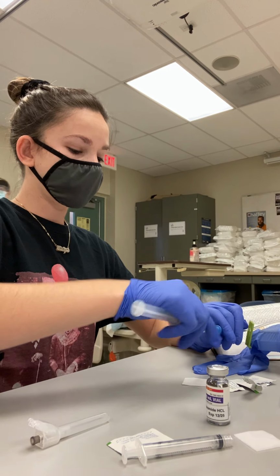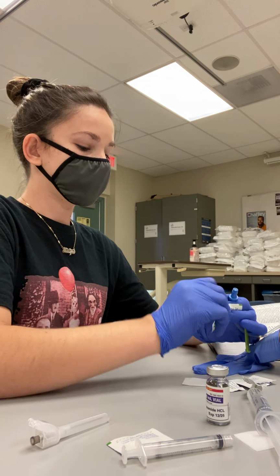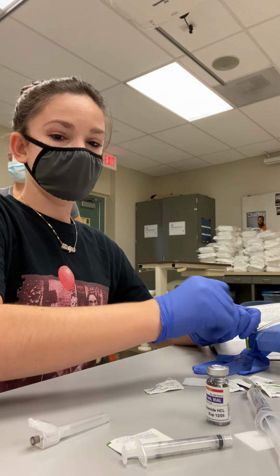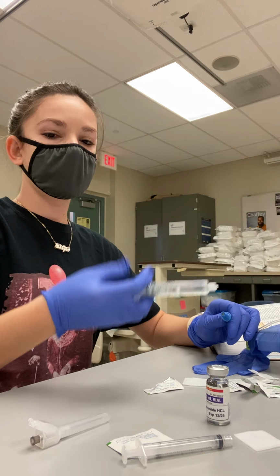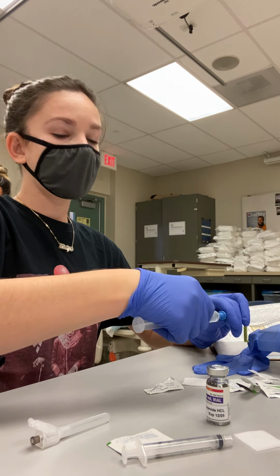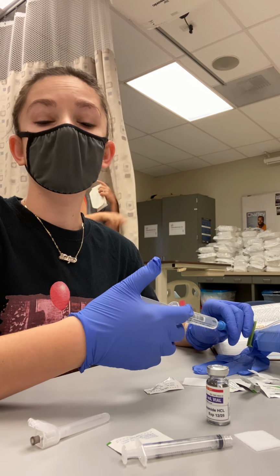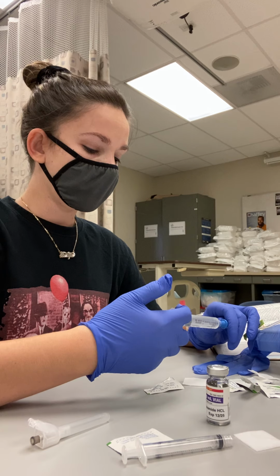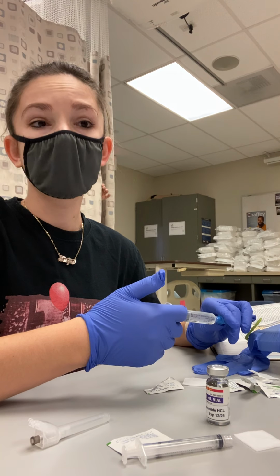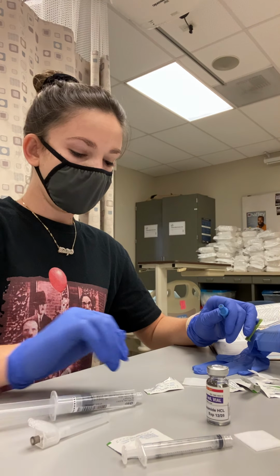So, before we get started, we want to check if there's something running. If there's something running, we want to pause the pump. We want to clean the hub, and depending on the prime amount, we could even unattach. Then you're going to do your second flush, and you're going to do it again over 2 minutes, so you can flush the same amount of normal saline over 2 minutes. So you're going to go 1/2 milliliter over the first minute, and then another 1/2 milliliter over the second minute. Then the assessment: vital signs.